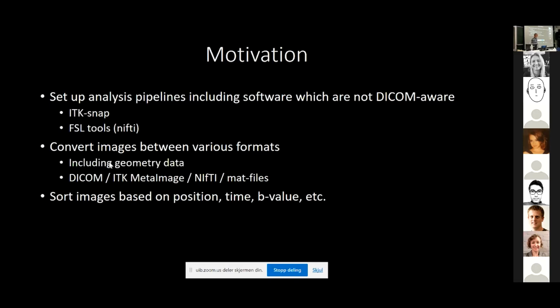DICOM in particular has this problem that you get slice by slice by slice, and you have to sort these slices into volumes, into, like, a dynamic acquisition if it's a time-dependent acquisition, etc. How do you sort all these slices into something useful? And then there is, of course, patient information, which is important if this is in the clinical setting. If you're going to bring your results back into the clinical setting, then we need to attach them to the correct patient and study.